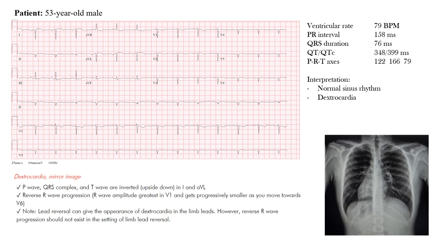Here we have a 53-year-old male coming in with this EKG, otherwise asymptomatic. This is showing dextrocardia, which is a rare congenital anomaly in which the heart is actually on the right side of the chest instead of the left. Looking at this chest X-ray, the heart is normally on the left side, but in this case it's over on the right — that's dextrocardia.